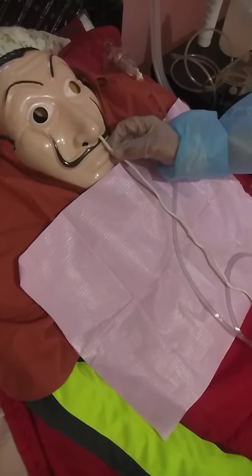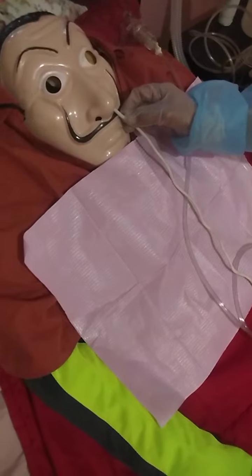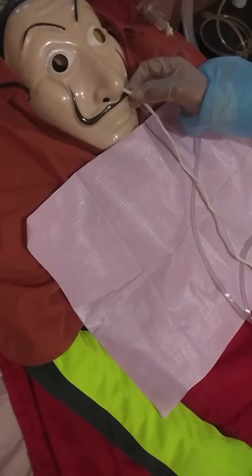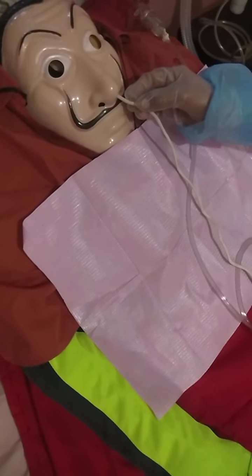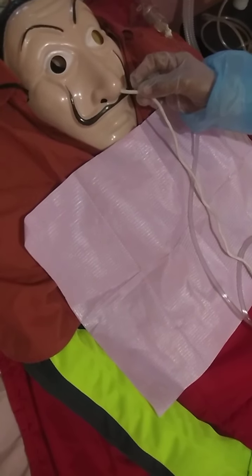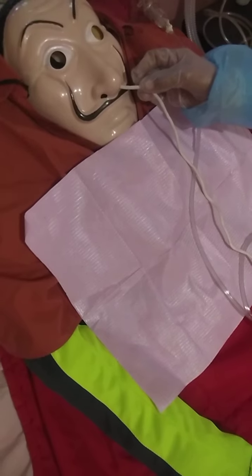In some instances, turning the patient's head can help you suction more effectively. Turning it to the right will help you reach the left mainstem bronchus, and turning it to the left, you reach the right mainstem bronchus.